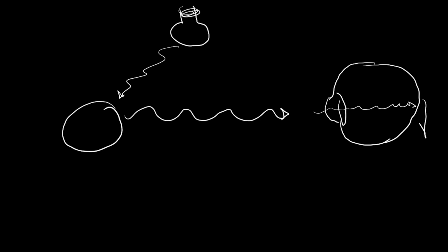These photons are very particular. Again, they do not have mass, but they are electromagnetic waves. And these photons can penetrate solid objects. One of the things you can see them penetrating all the time is, for example, a window. Even though the window is solid, the photons can cross through it and impact the retina almost the same way as if the window was not there.